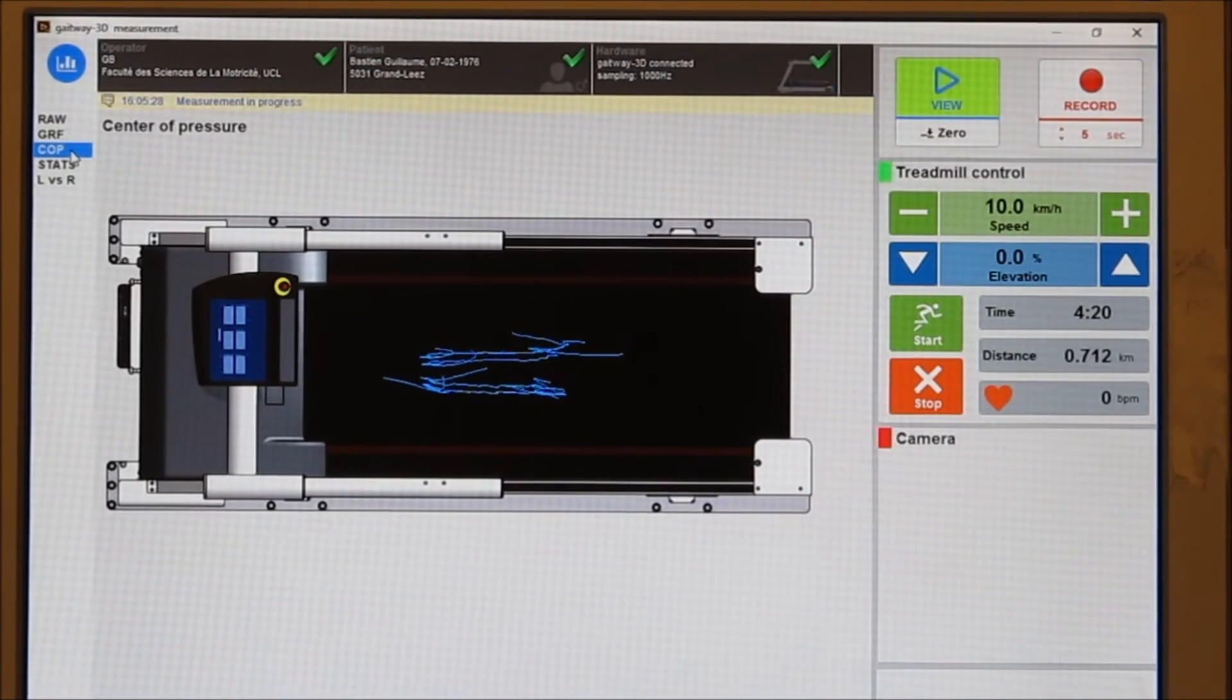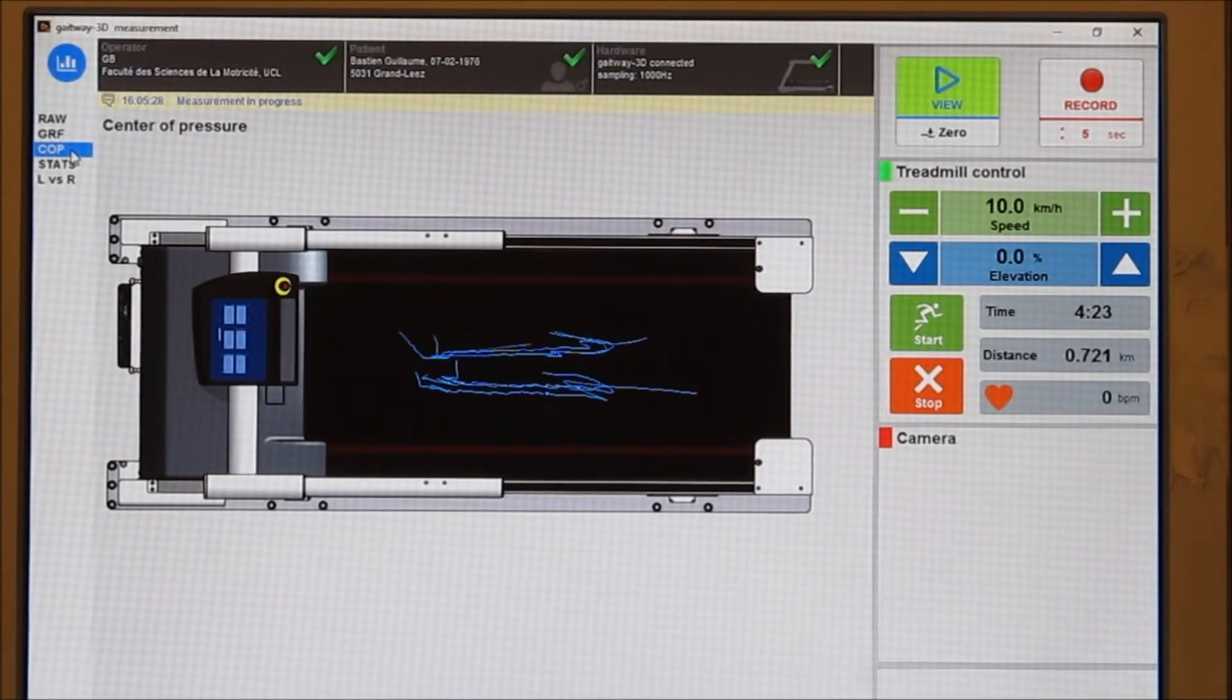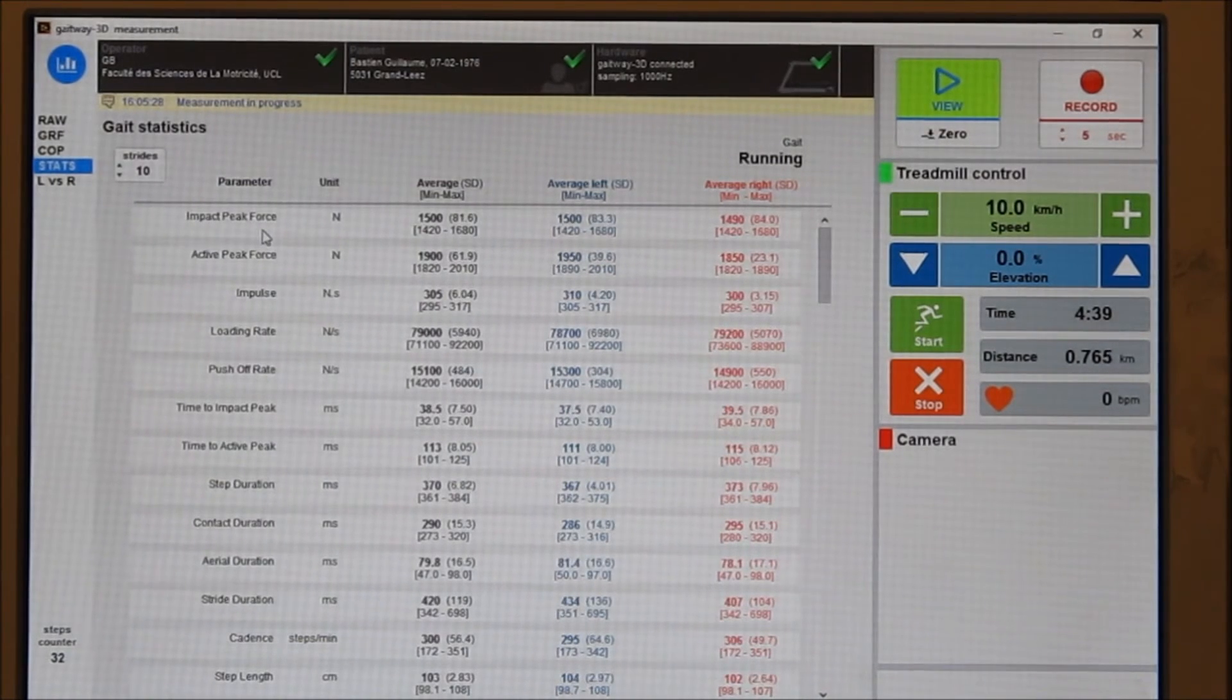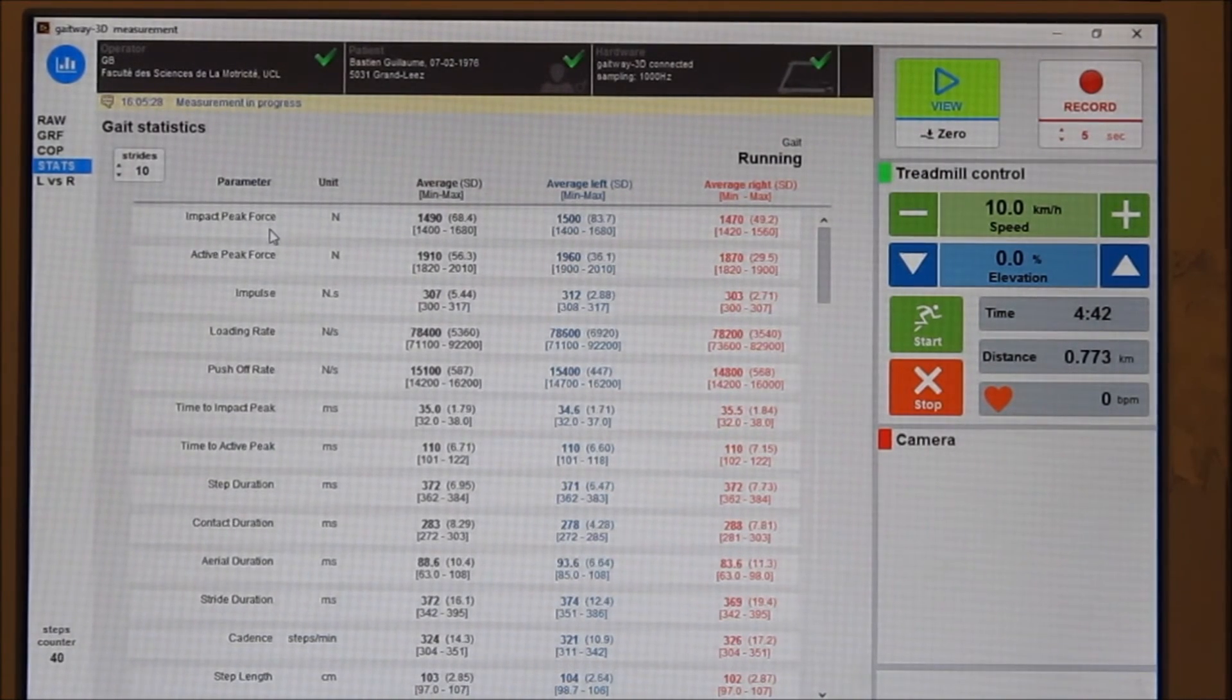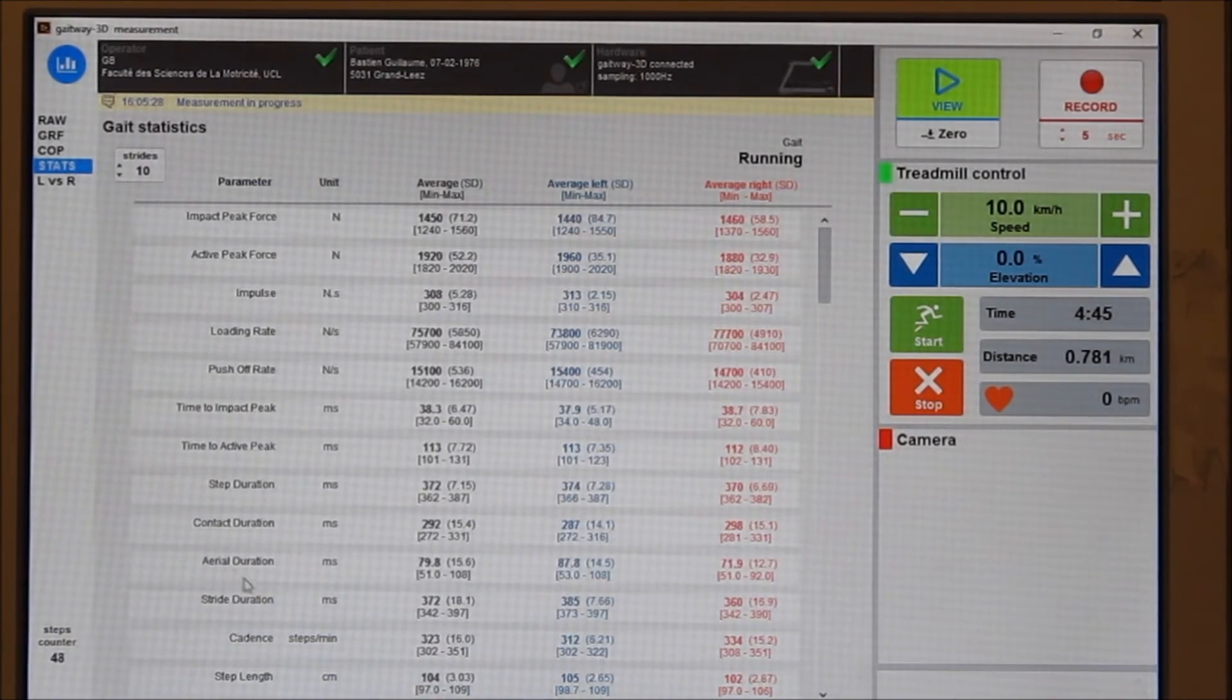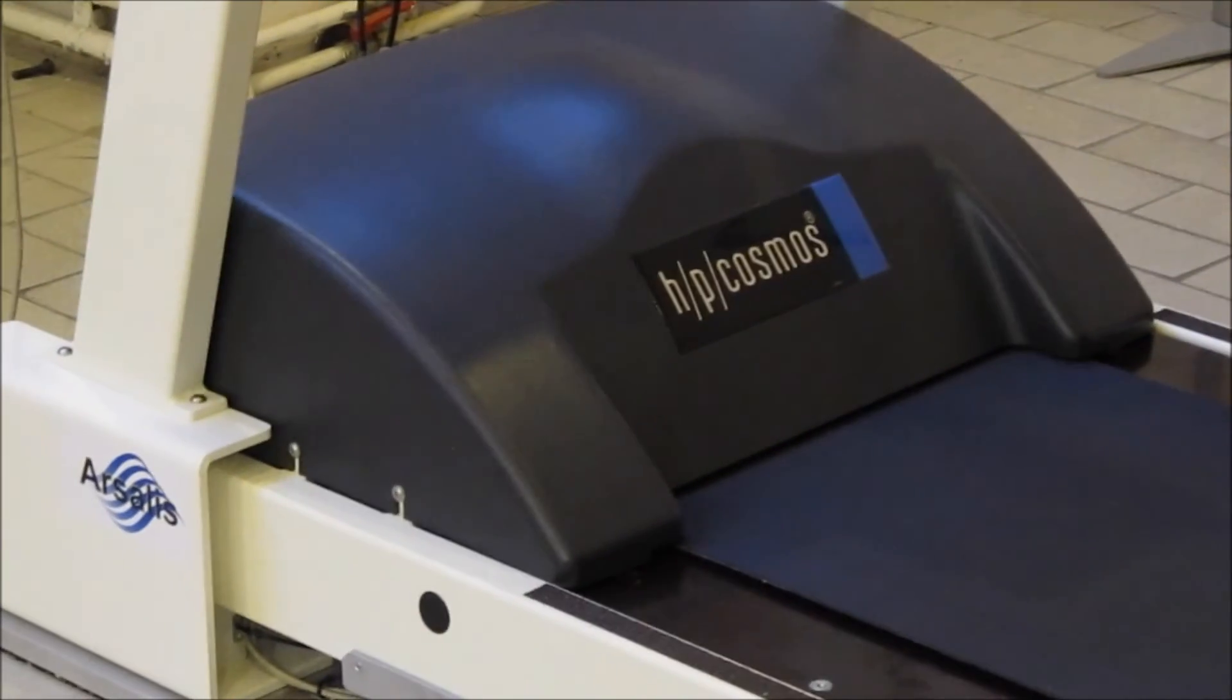The trajectory of the center of pressure is now quasi-linear under each foot. The list of parameters is also adapted to the running gait. It now includes the impact peak force that precedes the active force. The time of contact and aerial phases are also determined during the stride.